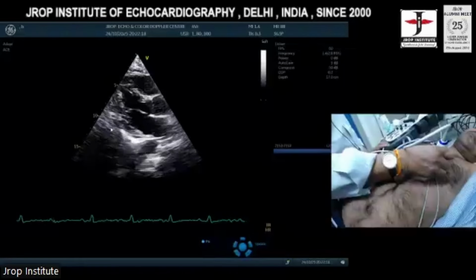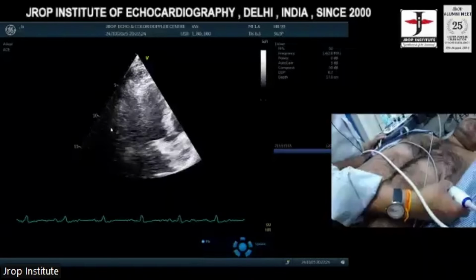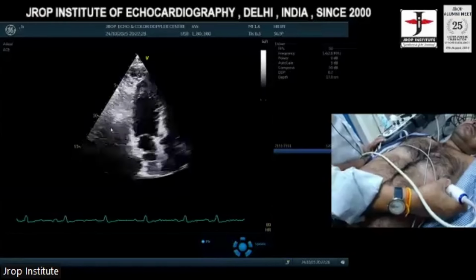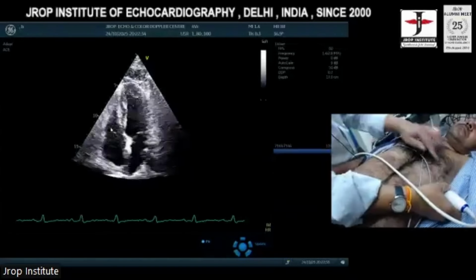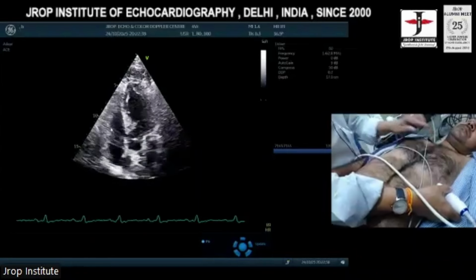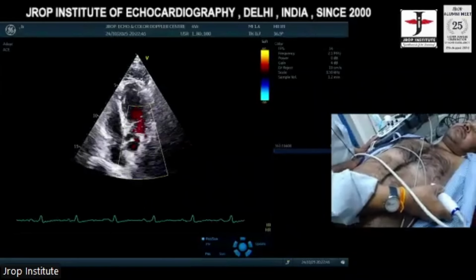So in case you have difficulty making an apical window, slide from Plaque's view, go all the way to the 3-chamber view, rotate clockwise for the 2-chamber view, rotate further clockwise for the 4-chamber view. Now let the footprint look towards the aorta. The 5th chamber, the aorta, opens up. This is a blue color. The aorta opens up. Correct?